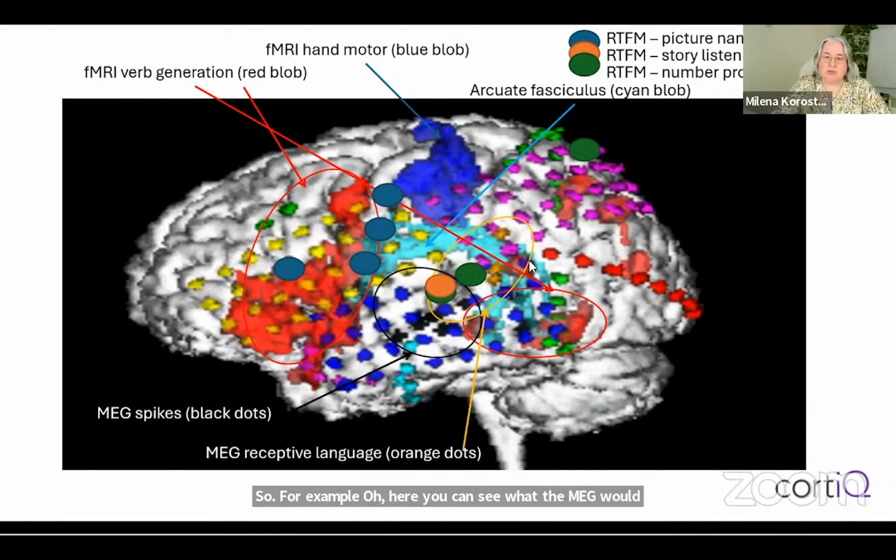But how far is it from these MEG spikes? We also get fMRI results, which are pointing us a little more posterior. Again, how far can we go with the resection, because there is even a MEG spike over here, if you can see. So when there is a lot of information that is really not very concordant, it's very important to have a gold standard that we always can rely on.